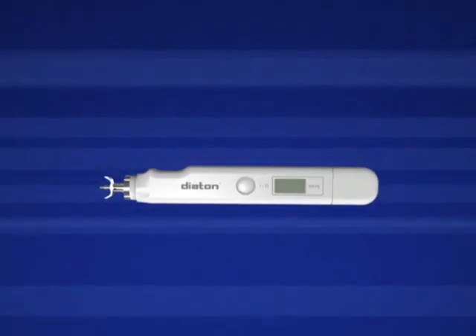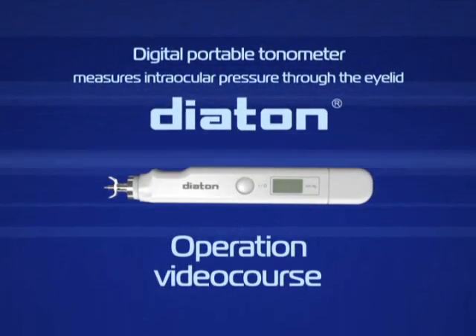Diaton tonometer measures intraocular pressure through the eyelid.